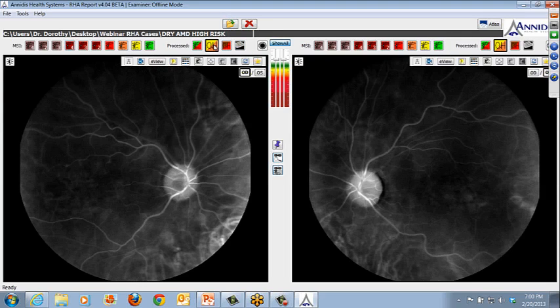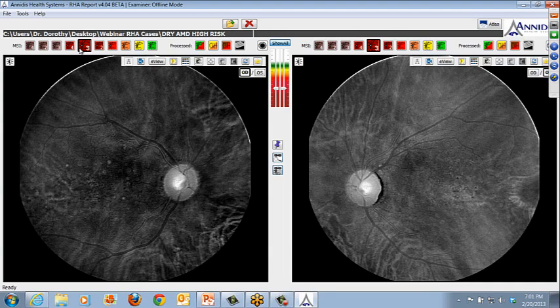So I'm just going to show the oxy map here as well. Again, I want you to look here in this area. This represents the area where there are either drusen or there's significant RPE atrophy. Okay, this is not hyperreflective here because there's oxygenated blood leaking. You actually can see down through to the choroid, but these are areas that you need to pay attention to. Now, toggling back and forth from the oxy map to red 3 will help you localize: is that really an area of generalized RPE atrophy, or is there something else going on there?